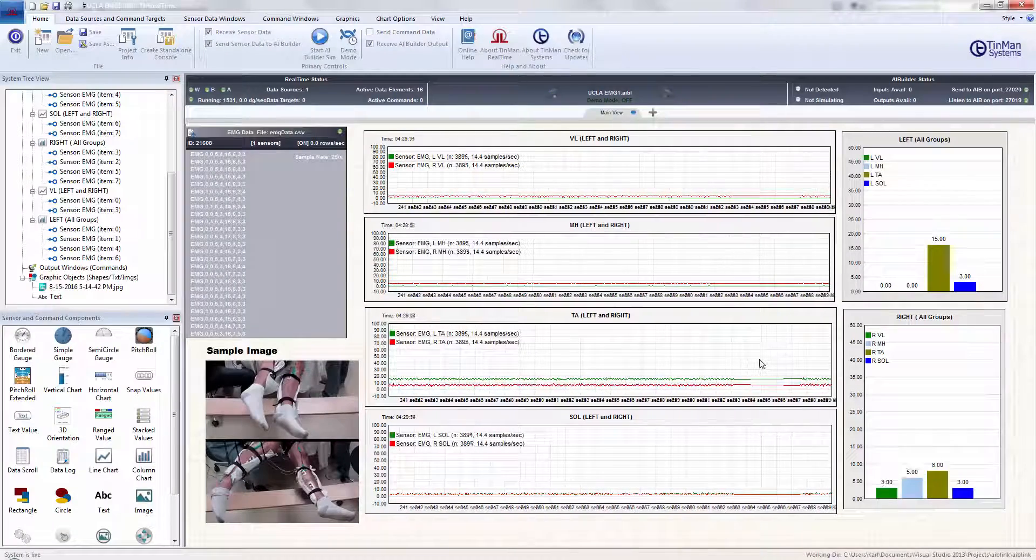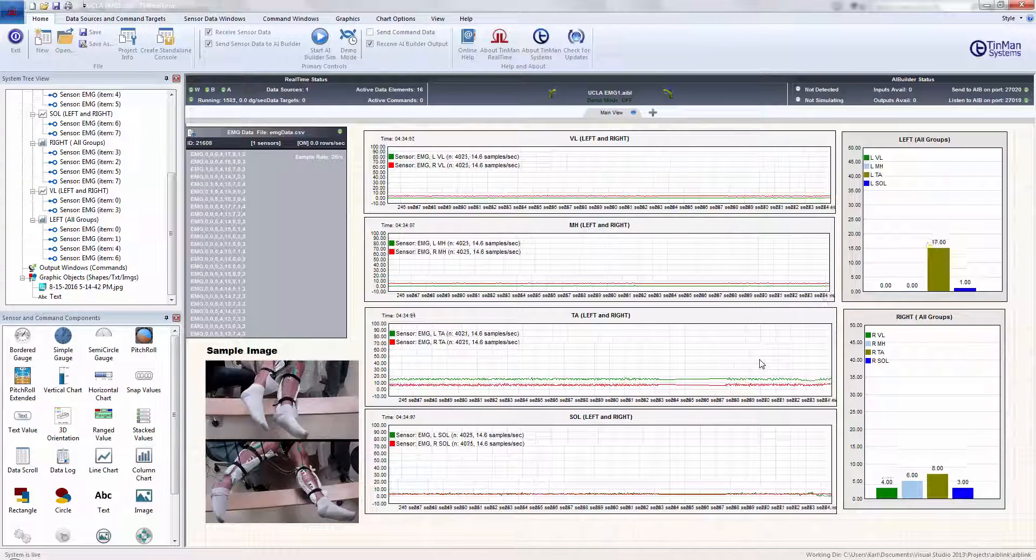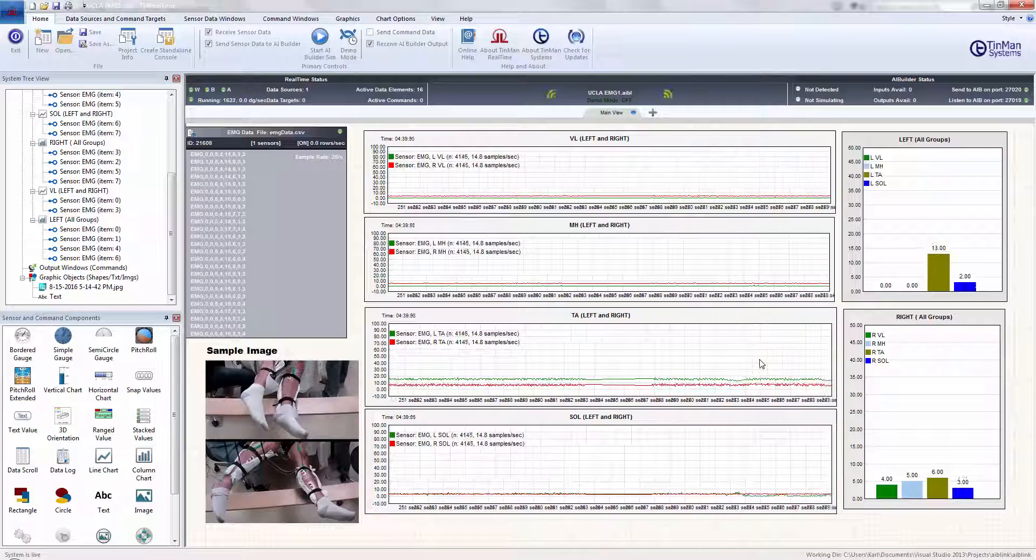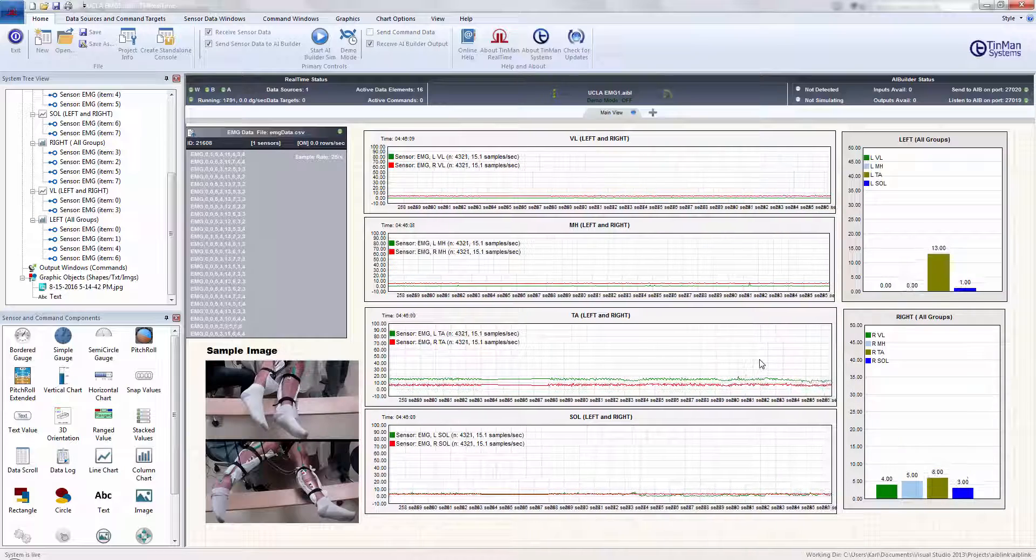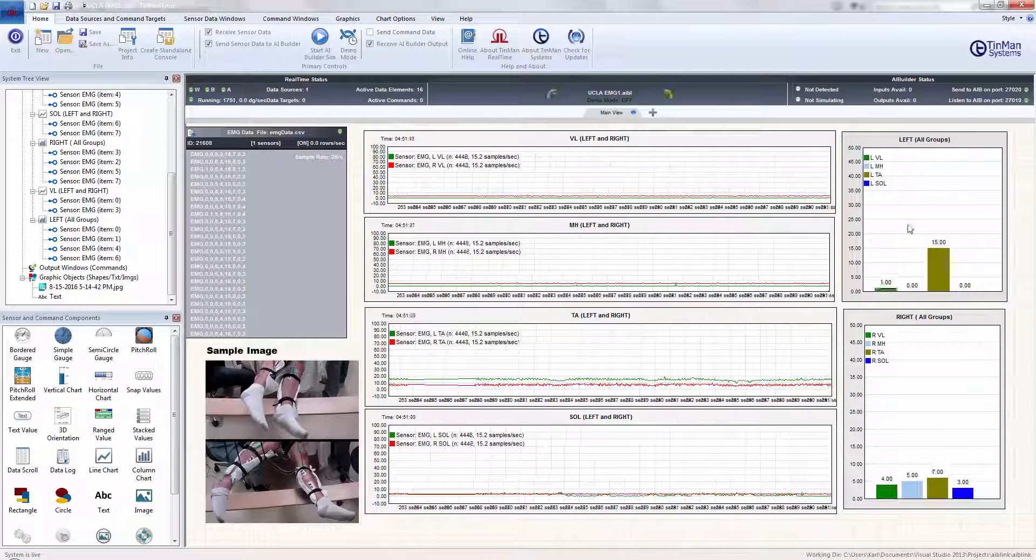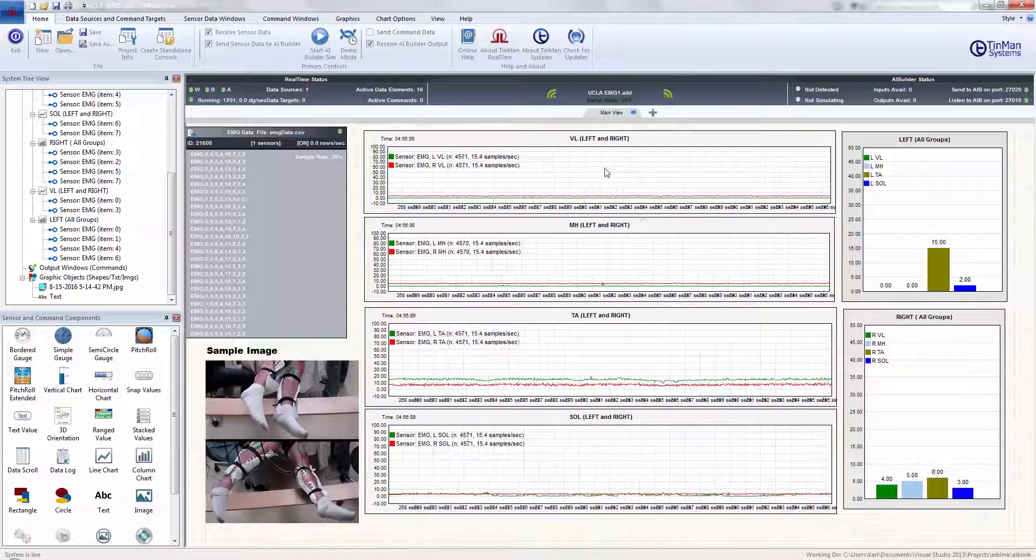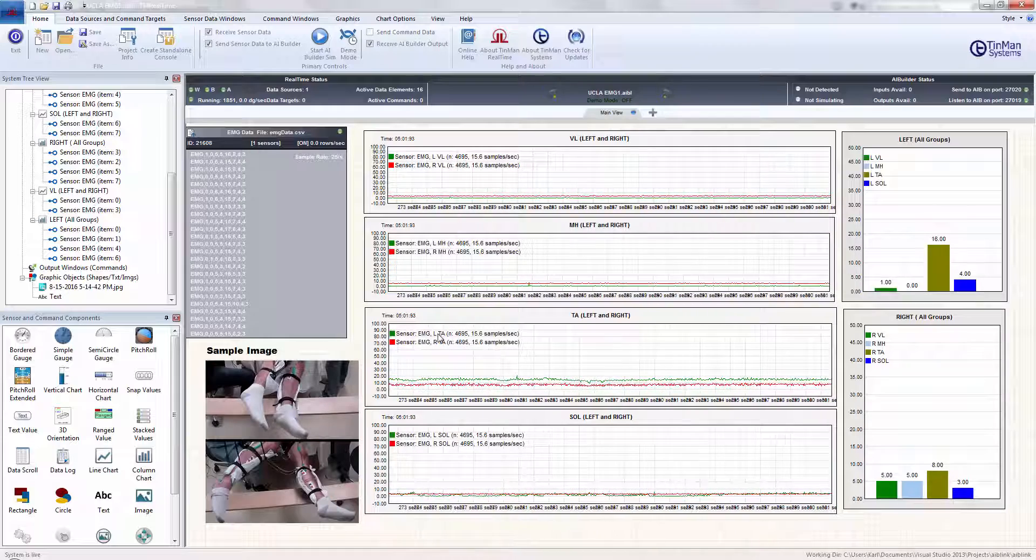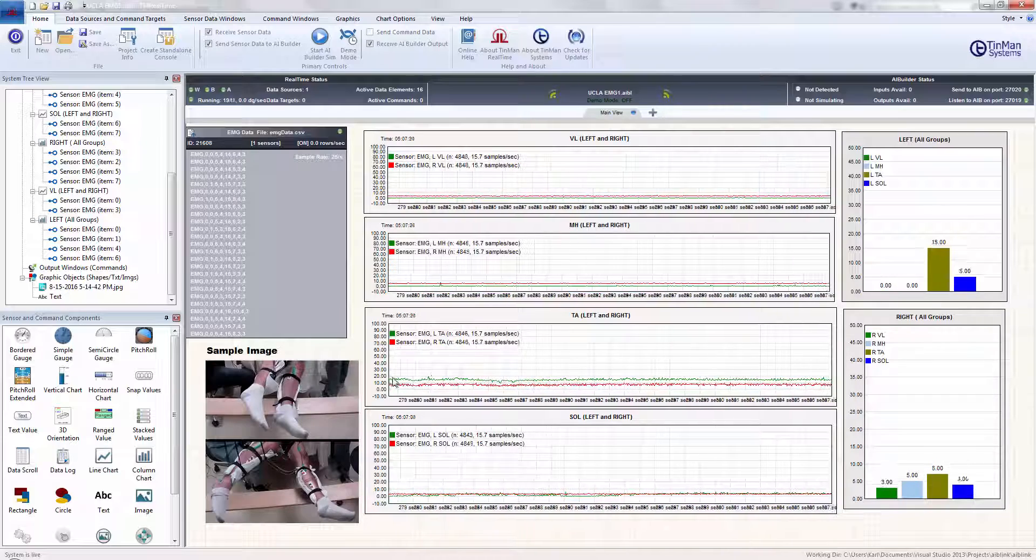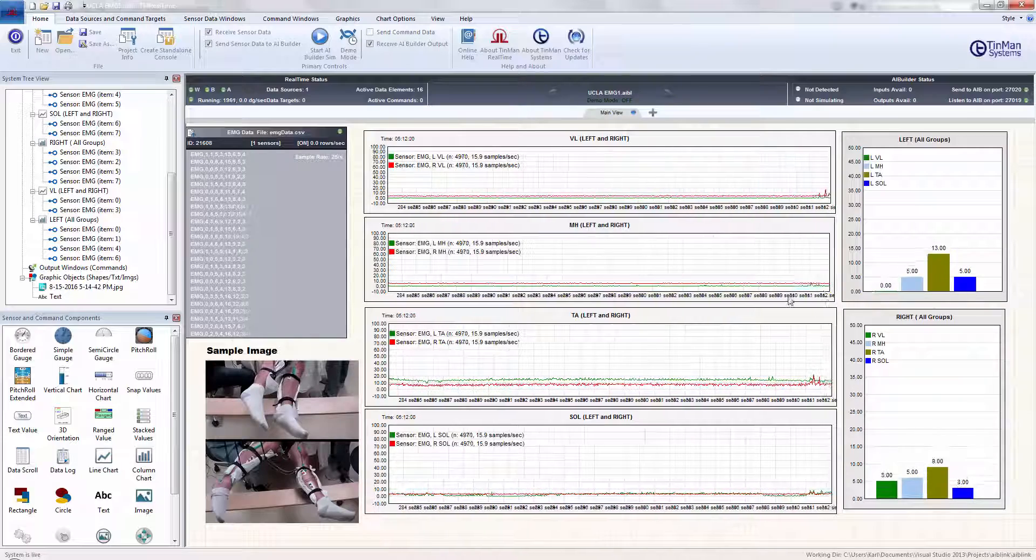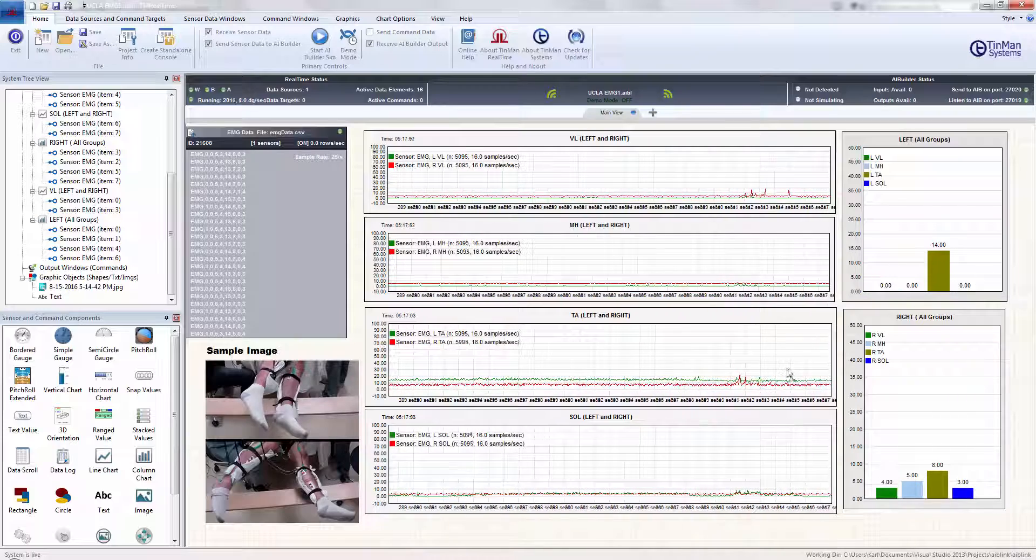There we go. And the interesting thing that jumps out at me, and I'm not familiar with all the details of the study or the findings so far, is that you have this kind of constant EMG activity on the left tibialis anterior and it just really doesn't change. We can see that here. That's the left TA at sample number 4770 there. And you can see that we are constant right at about exactly what that's showing, 12 to 15 microvolts. And that doesn't seem to change.